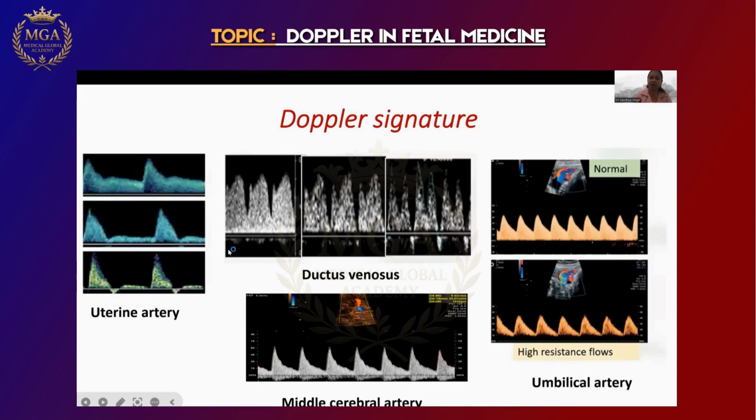This funda is the same for every vessel. If it's a middle cerebral artery, same. This is systolic and this is diastolic. If it's an umbilical, see, this is systolic and this part is the diastolic flow. This formula maintains in all the arteries.